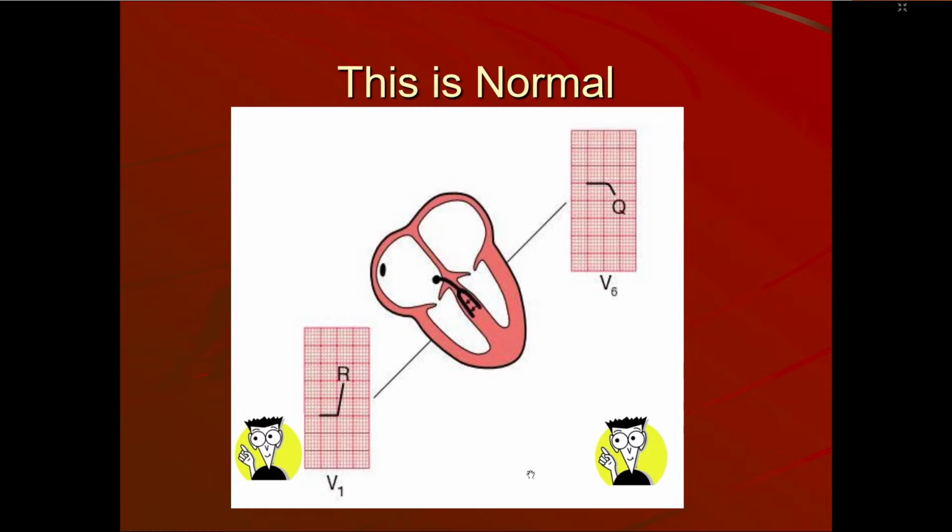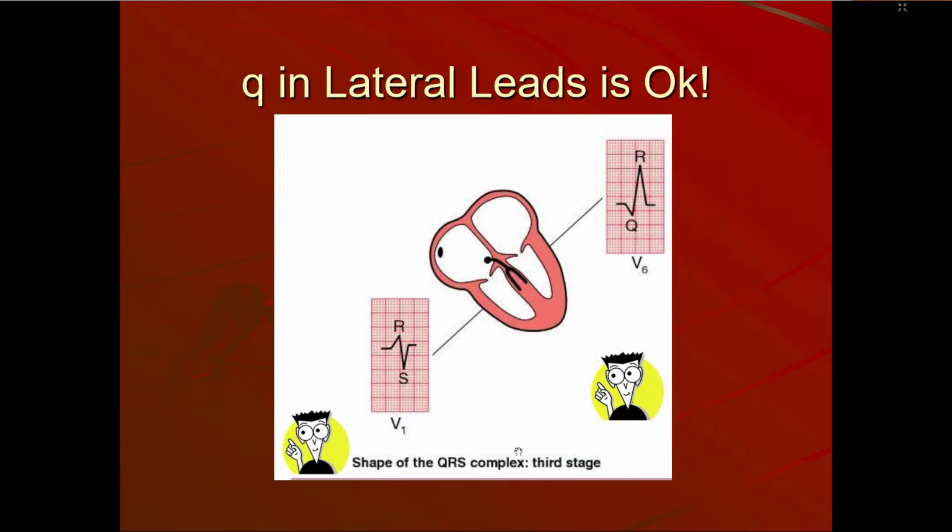So it has to be there. Normally it should be there. And if it is not there, maybe there is an MI occurring. And if it is a very bulky, hypertrophic interventricular septum, you will get a deep Q in V6, which will simulate an MI, actually when there is no MI. So that's why it is very important.